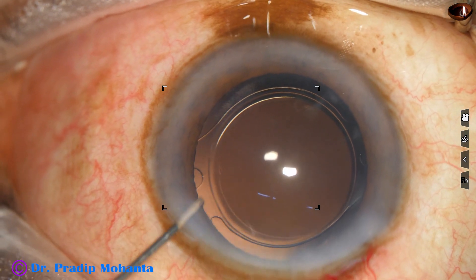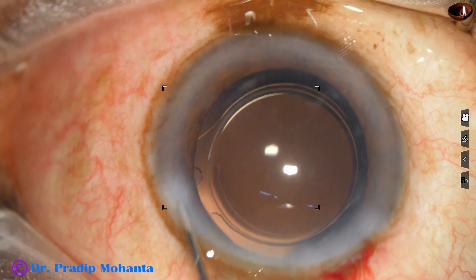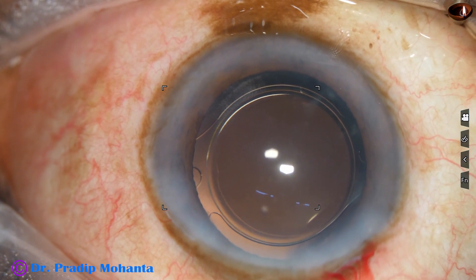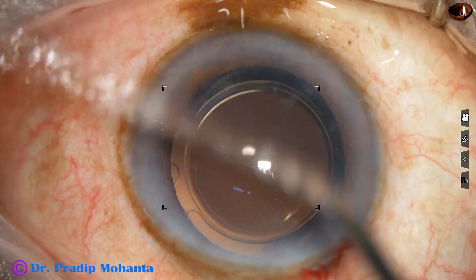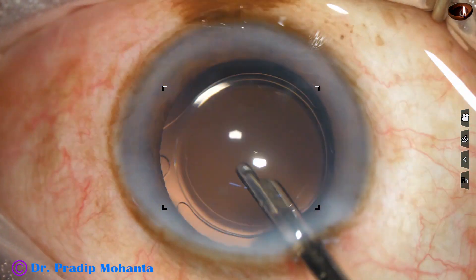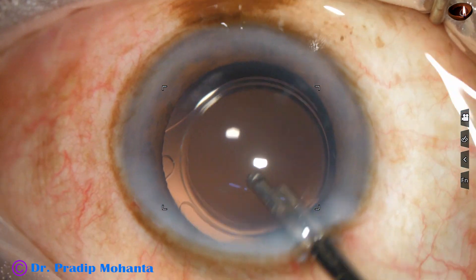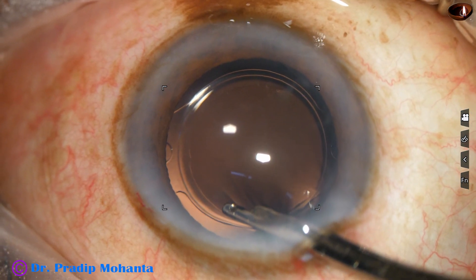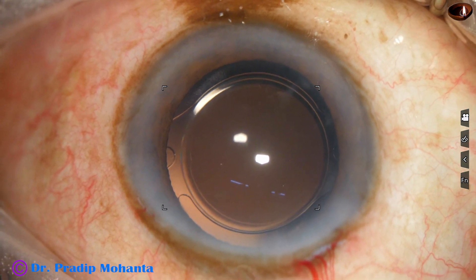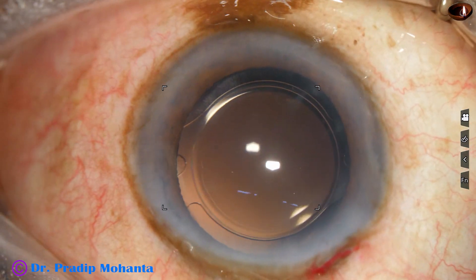This is a bit of moxifloxacin. The side port is closed by hydrating the corneal stroma, and now a final lavage of the anterior chamber is done. Any viscoelastic that sticks to the corneal endothelium is removed by a gentle stream of BSS directed towards the corneal endothelium. The anterior chamber is formed nicely, and the integrity of all the wounds is checked. A few drops of moxifloxacin are applied over the corneal surface, and the case is concluded.